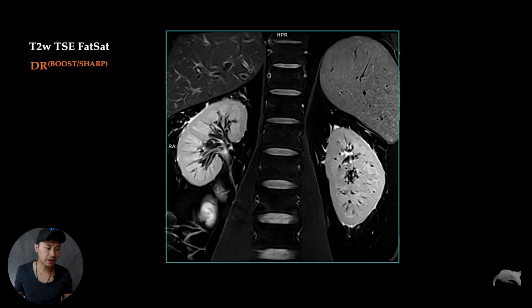And the next thing I had in mind was a T2 Turbo Spin Echo Fat Sat, 2D, just standard, combined with Deep Resolve Boost and Sharp. So this is a breath hold, 2 times breath hold, of course. So with 3 millimeters it covers the whole kidney. And there are amazing results because the coils are there, the patient position is correct. Just some thoughts I wanted to give to you, and try it out if you have the possibilities to do so. But you can see here the images are clearly working when it comes to those coils in combination, right?